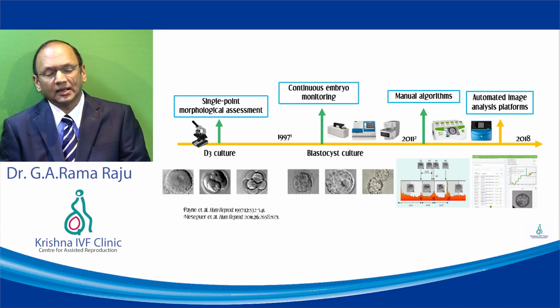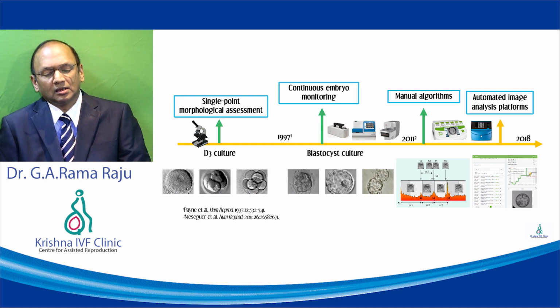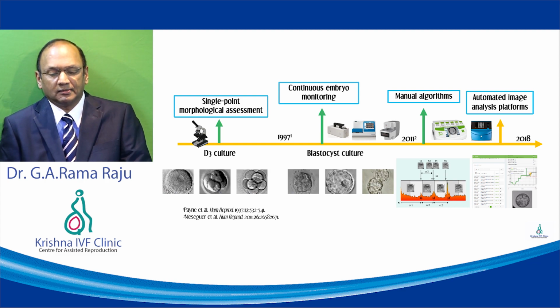In summary, time-lapse technology before 1997 was a single point morphological assessment, wherein an inverted microscope was kept in the incubator and monitored.